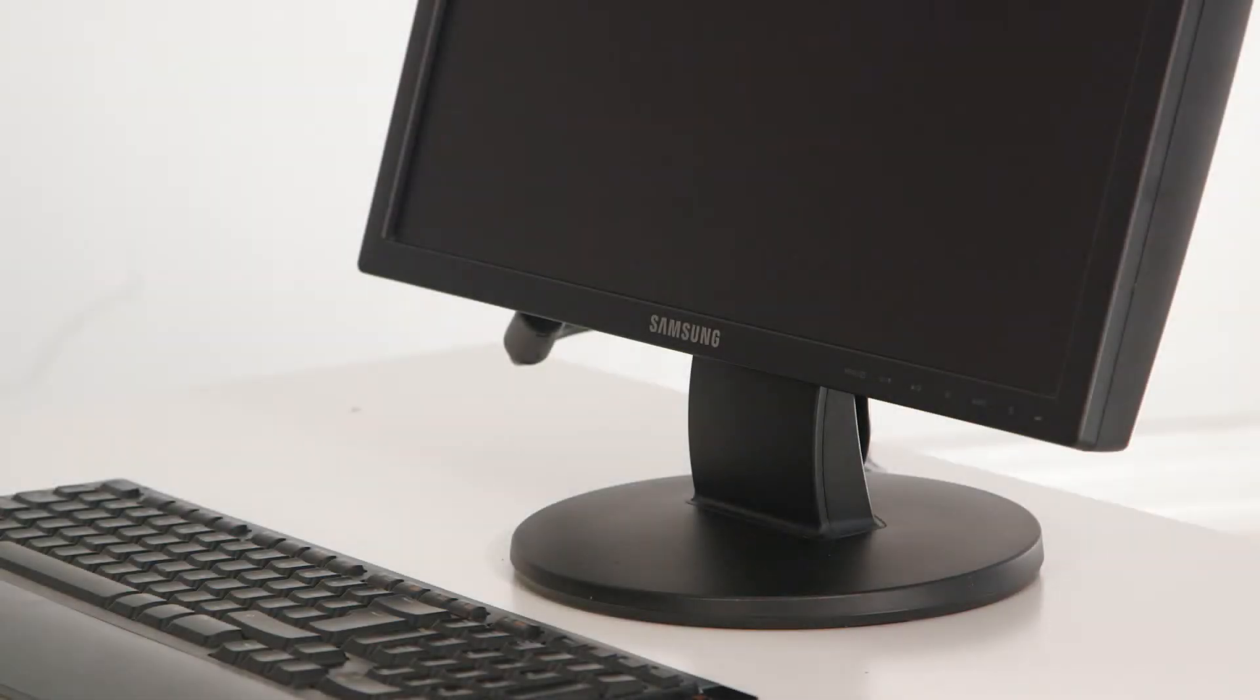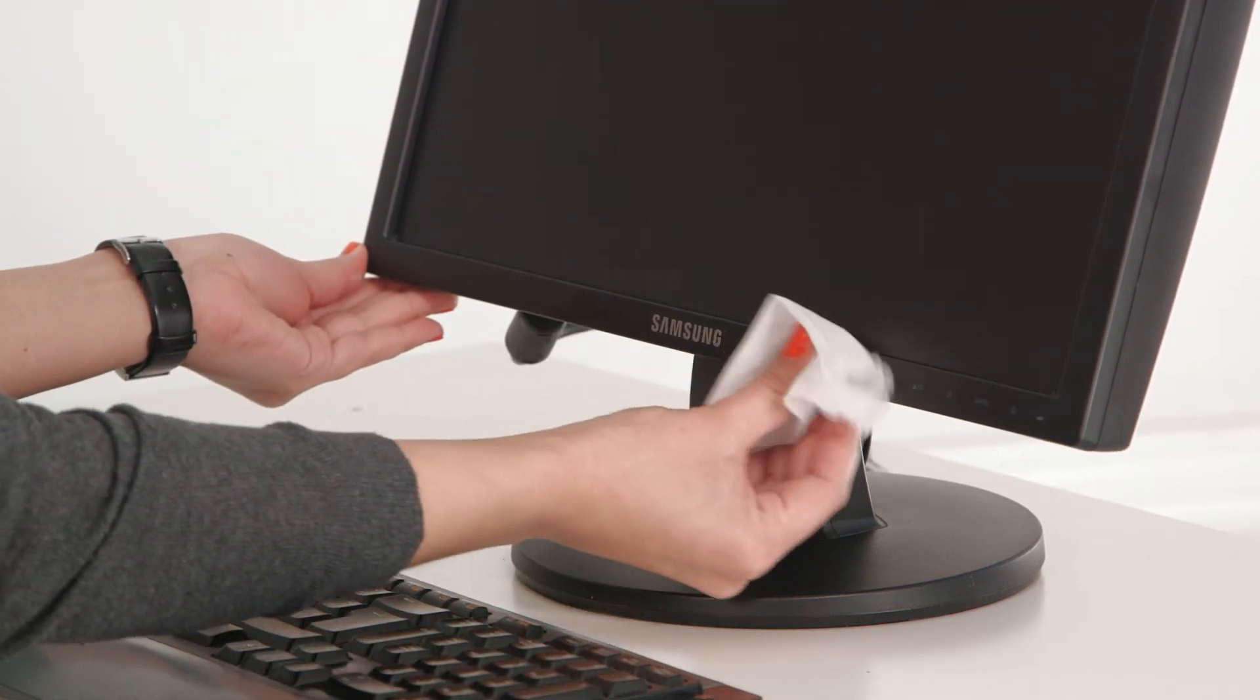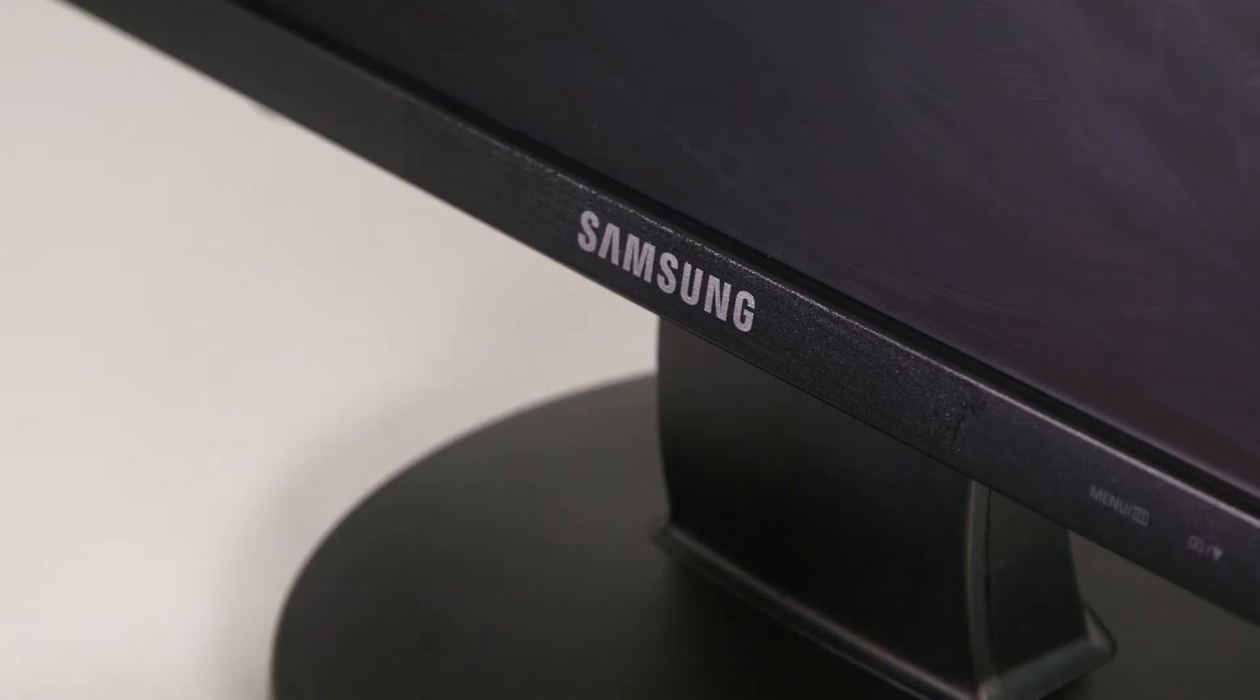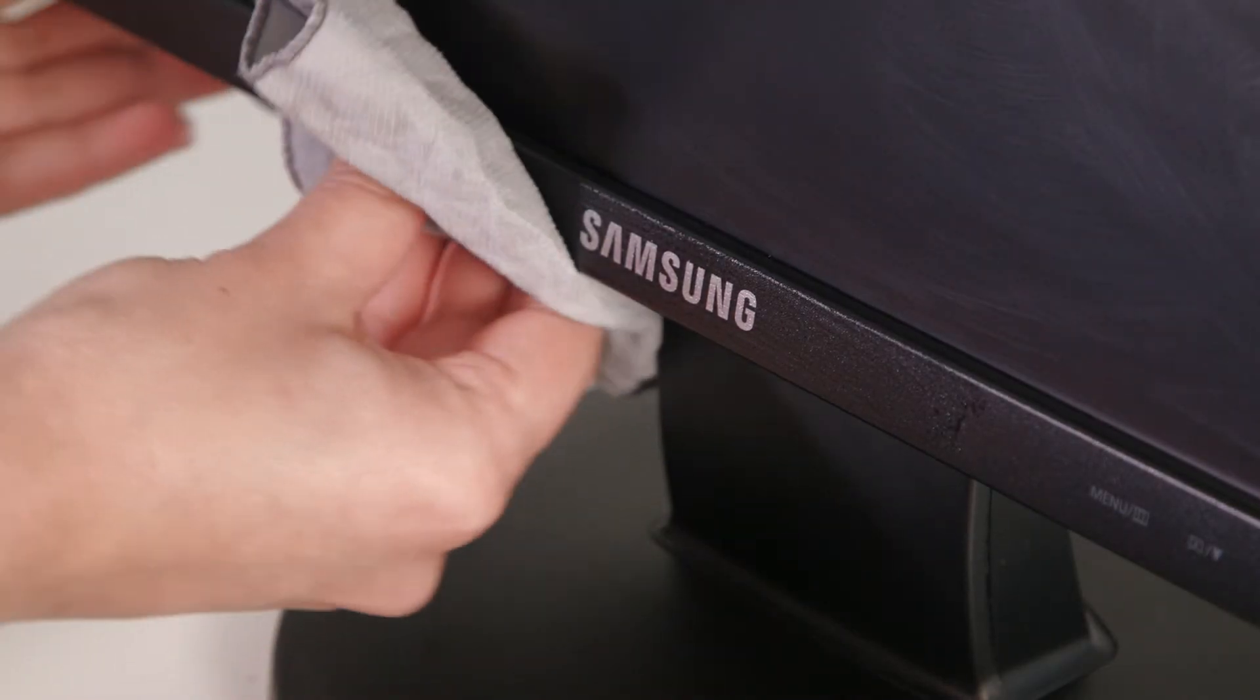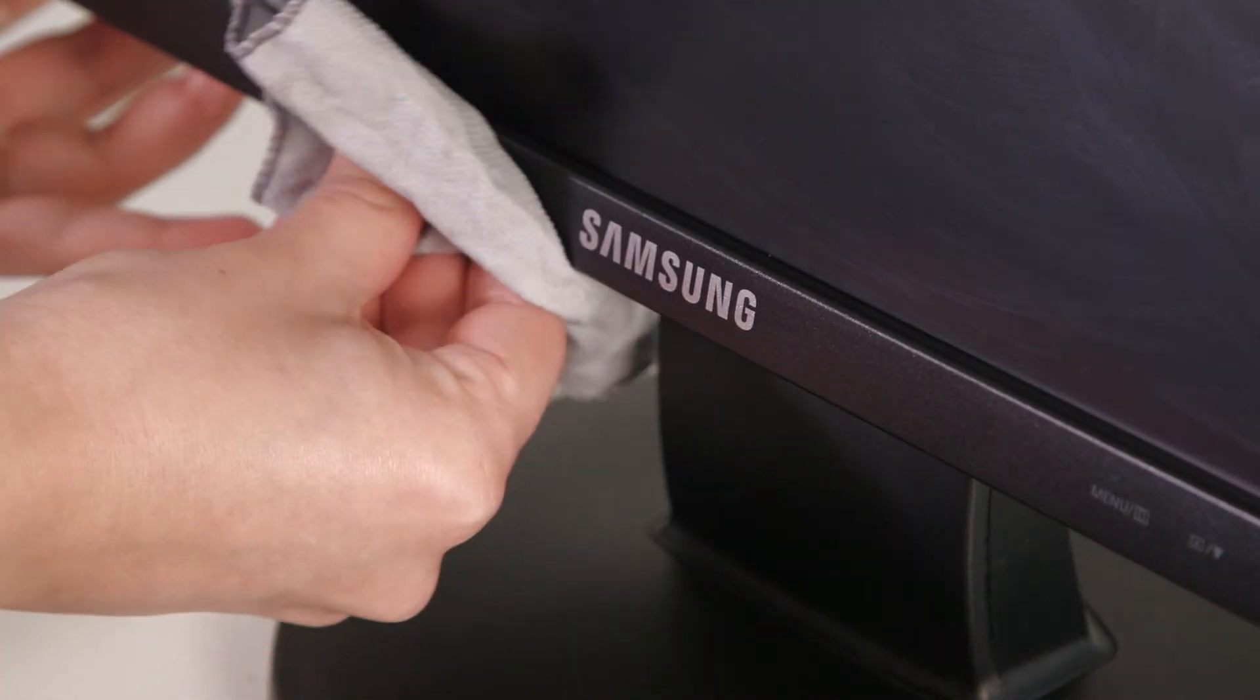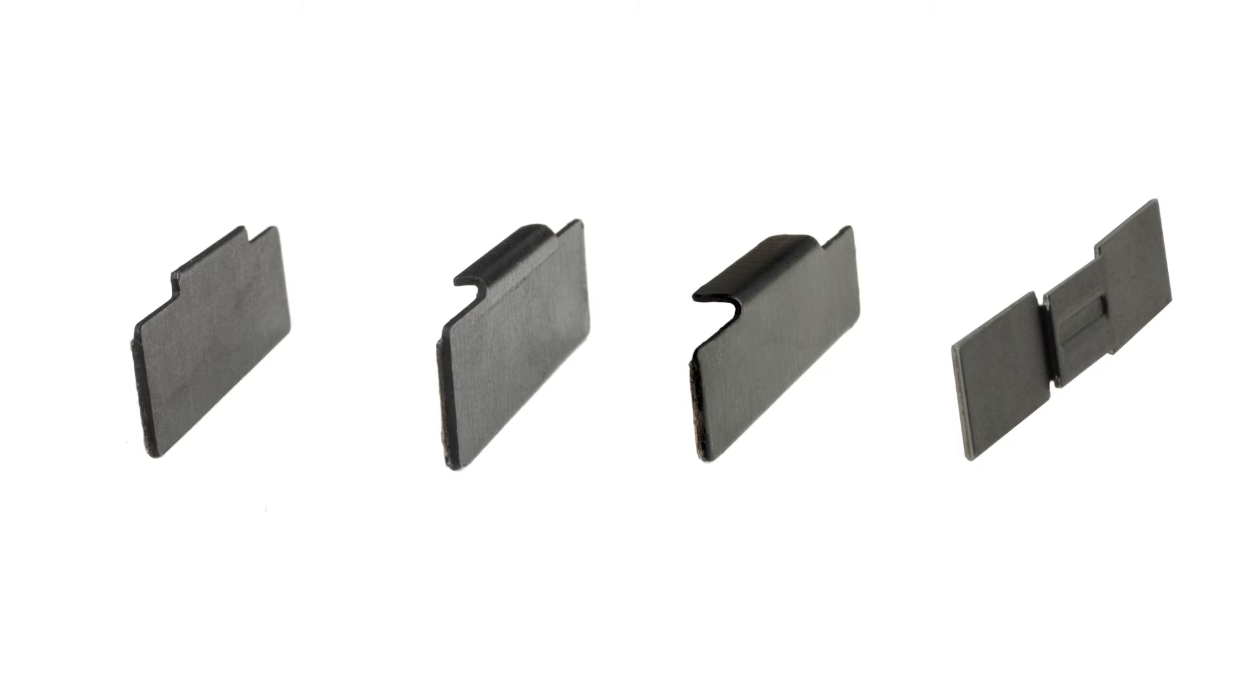Before mounting the Tobii X2 eye tracker on the display frame, make sure the area where the Tobii X2 eye tracker will be mounted is free from dust and dirt. Because screens come in different shapes, select the bracket appropriate for your screen.